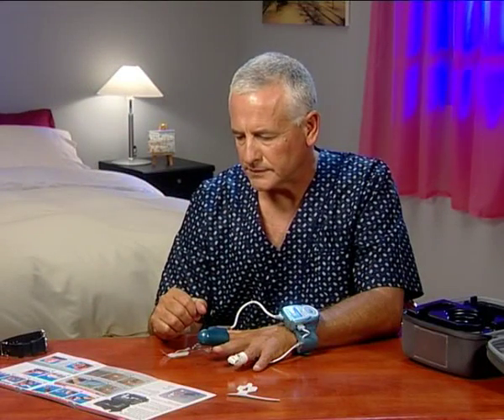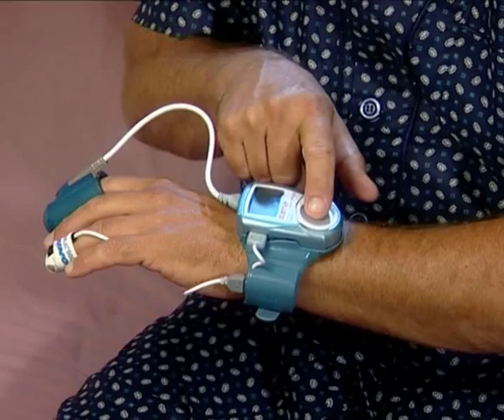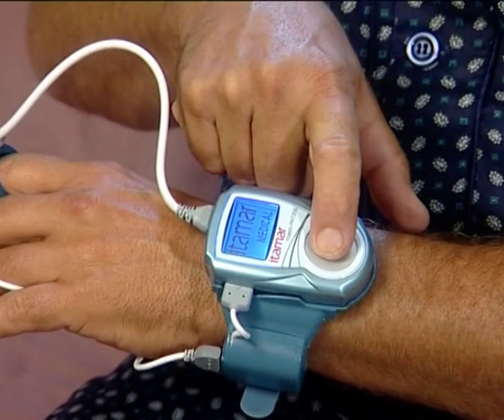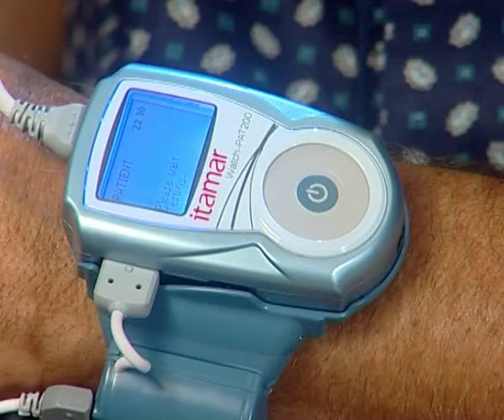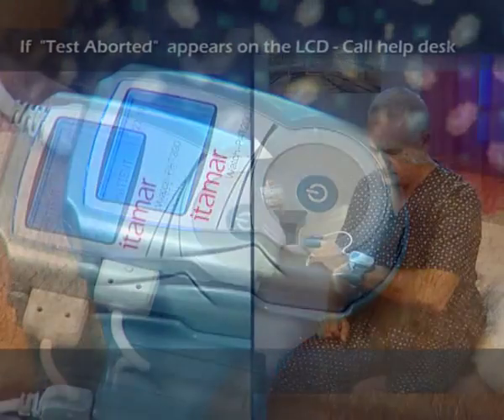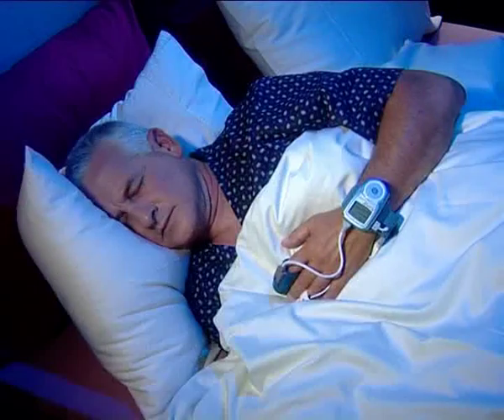Now you are ready to turn on the WatchPat. Get into bed and press firmly on the round button for a few seconds. Keep pressing until you see 'Itamar Medical' on the LCD screen. After 30 seconds, 'Good Night' in the middle of the screen indicates that the study has started. If there is a problem, you will see 'Test aborted' — note the error code and call the help desk. The WatchPat is now working properly, and it's time to go to sleep.